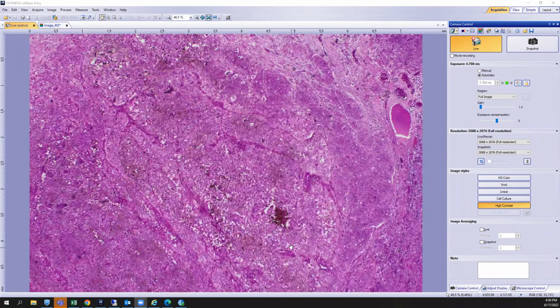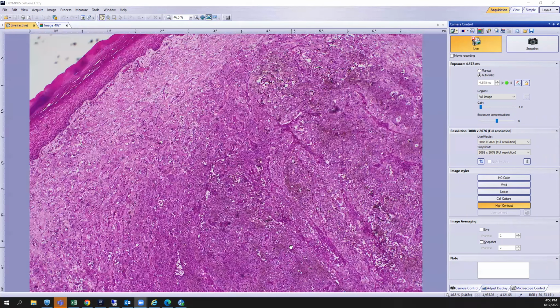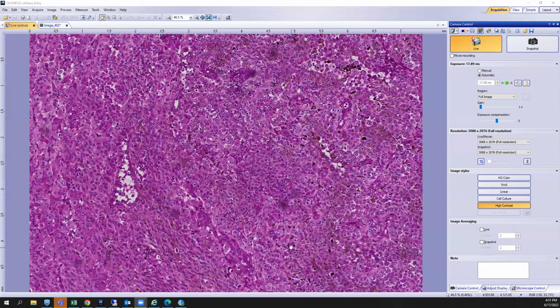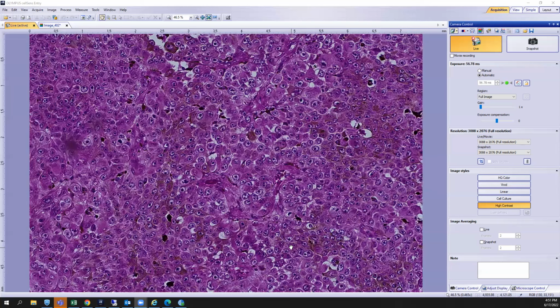It's composed of multiple epithelioid cells that appear to be trying to nest, but not doing a very good job of it. Mostly a sheet-like pattern of growth, pretty wall-to-wall here of atypical epithelioid cells. You can notice the very prominent nucleoli among the cells. There's scattered pigment in between some of them and scattered mitotic figures as well.